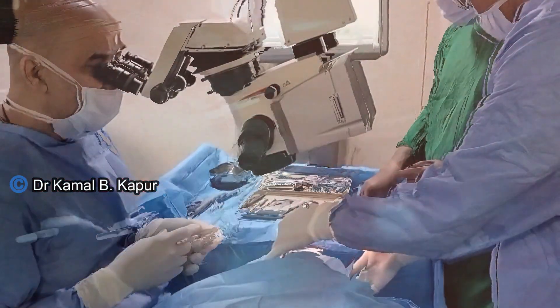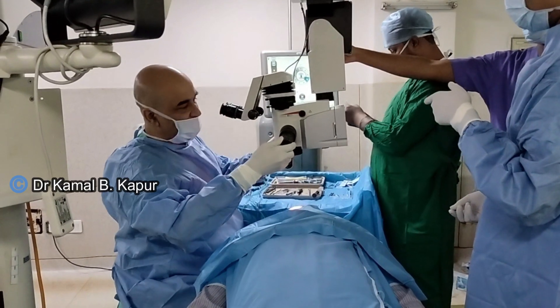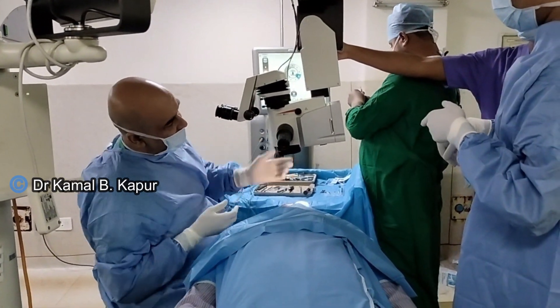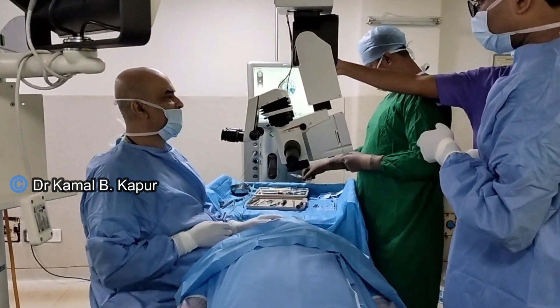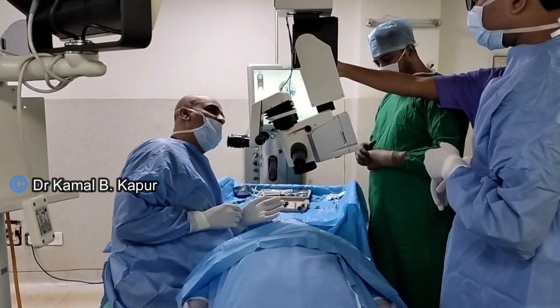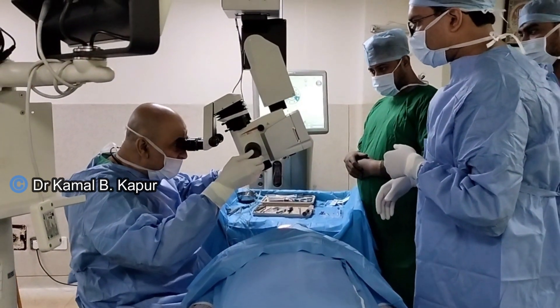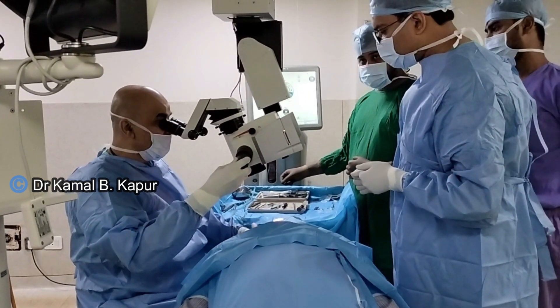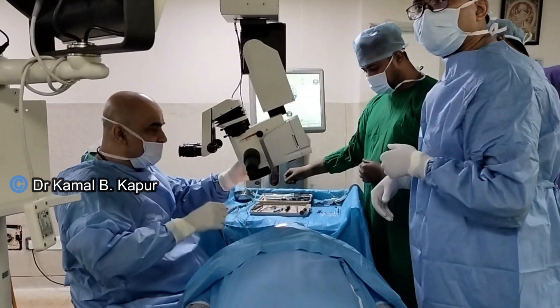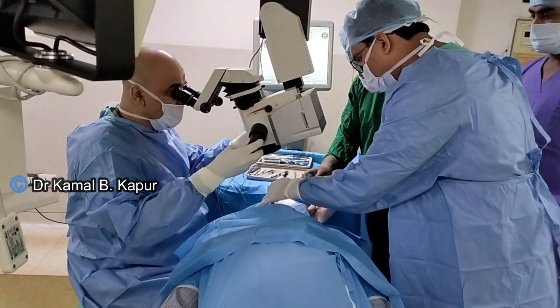Once this is done, we start tilting the microscope approximately 30 to 40 degrees away from us, and the head of the patient is turned approximately 45 degrees away from us. This gives approximately 80 to 90 degrees of en-face view of the angle and its structures. This is a very important step — if not done properly, it will hinder visibility of the trabecular meshwork, the scleral spur, and the ciliary body.